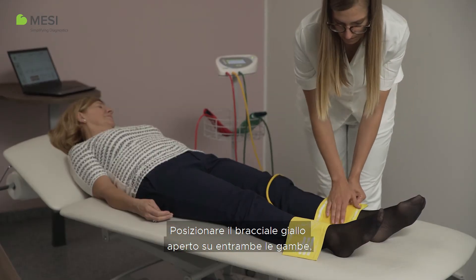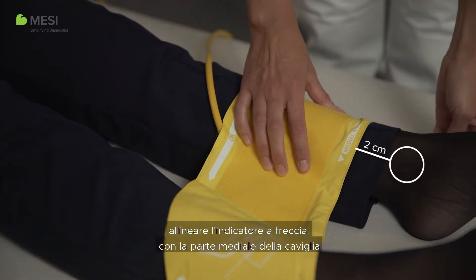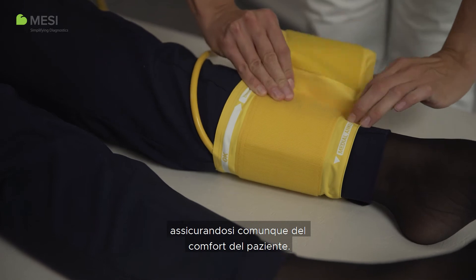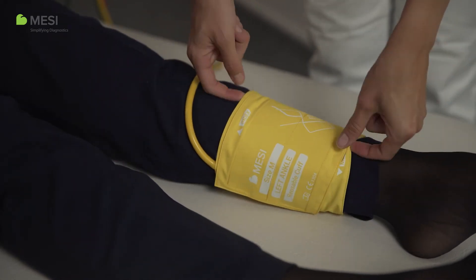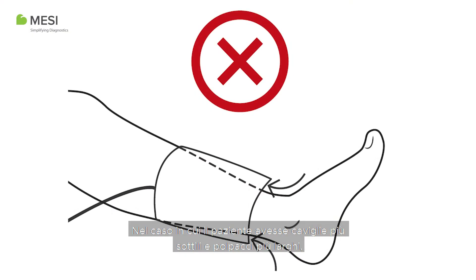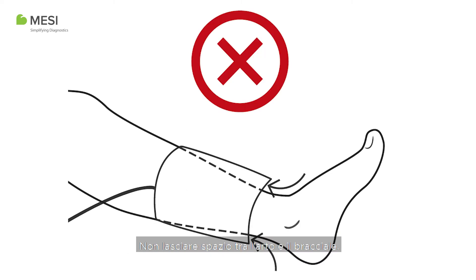Place the open yellow cuff across both legs, align the arrow indicator with the medial ankle, and wrap the cuff around the leg tightly whilst still ensuring patient comfort. In case the patient has smaller ankles and larger calves, please make sure you place the cuffs so they follow the leg shape as demonstrated. Do not leave any space between the limb and the cuff.